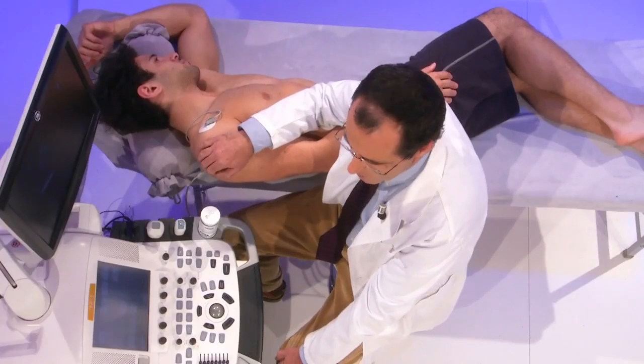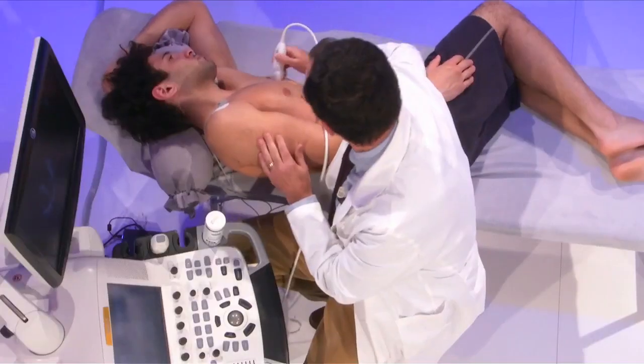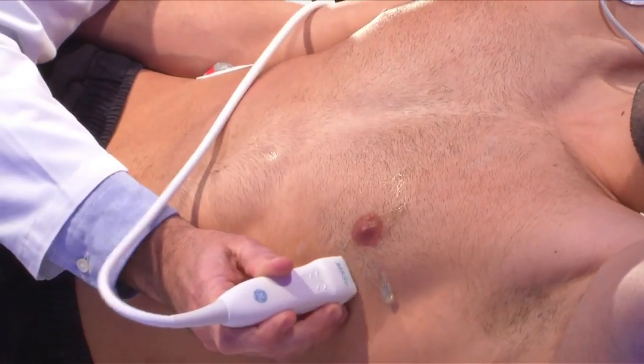He had a stressful event some days before, and despite not having risk factors for coronary artery disease, his ECG showed elevation of the ST segment in the precordial leads. Of course, it was obvious he had to go to the cath lab, but we performed an echocardiogram just before the cath lab.